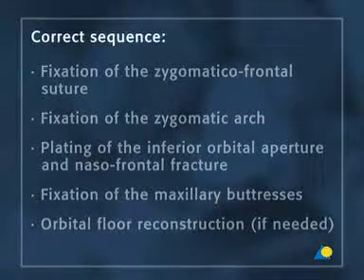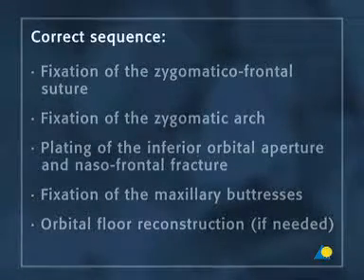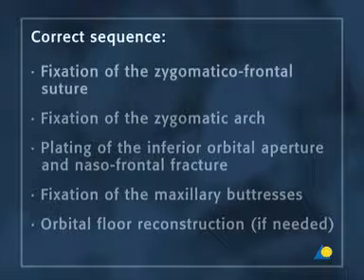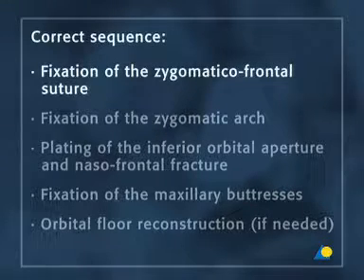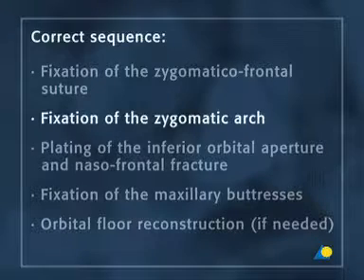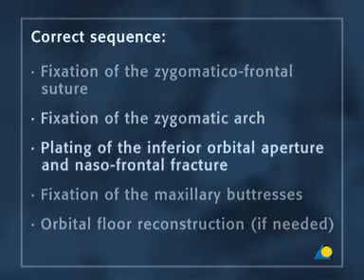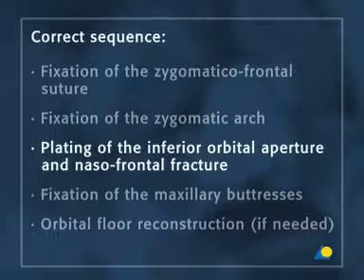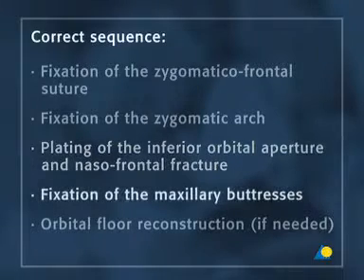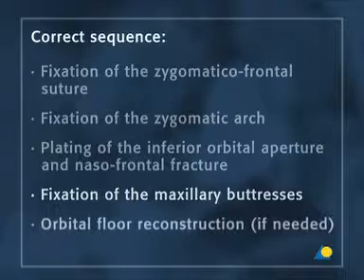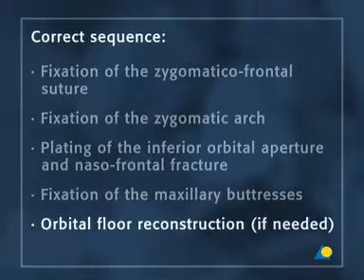The correct sequence to fix this fracture is composed of five steps: fixation of the zygomatic frontal suture, fixation of the zygomatic arch, plating of the inferior orbital aperture and nasal frontal fracture, fixation of the maxillary buttresses, and if needed, orbital floor reconstruction.